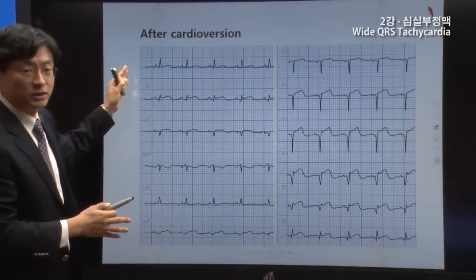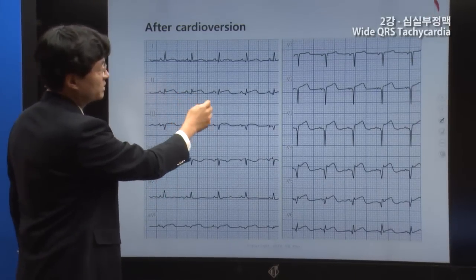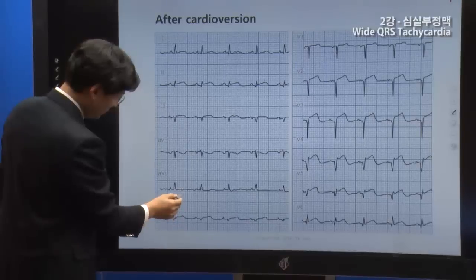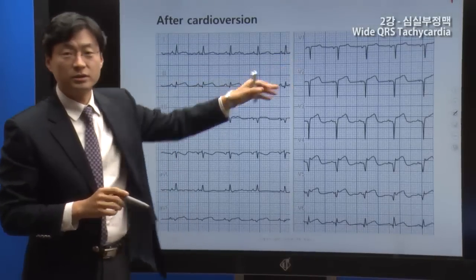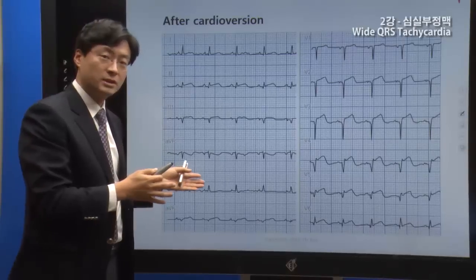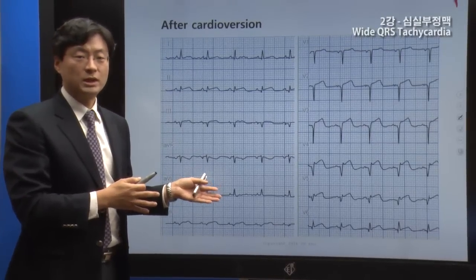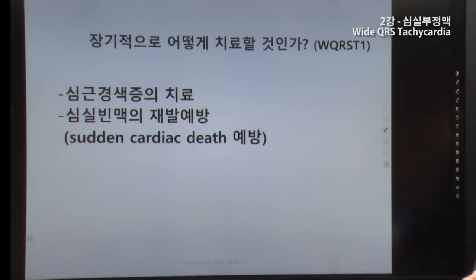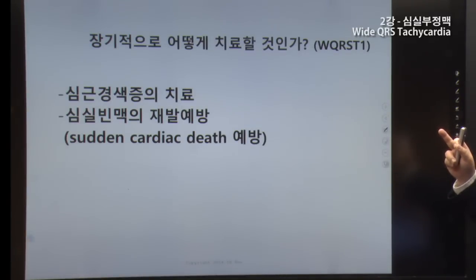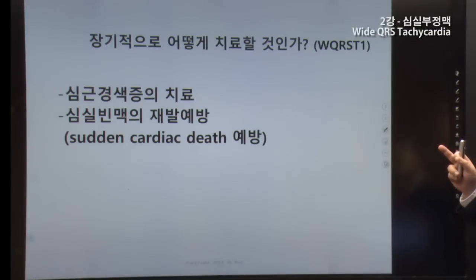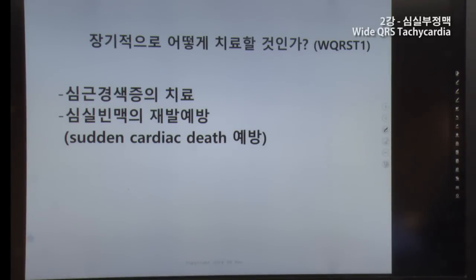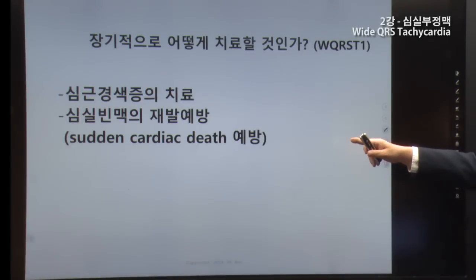After cardioversion, sinus rhythm was restored. However, ST changes are visible in leads V1 through V5, and there are Q waves in V2 and V3. This finding is consistent with VT associated with myocardial infarction. Treatment should address the underlying cause — this patient requires appropriate management for the associated ischemic condition.